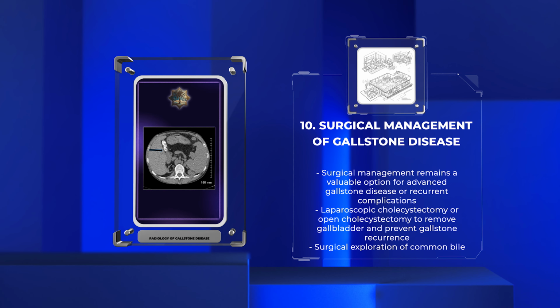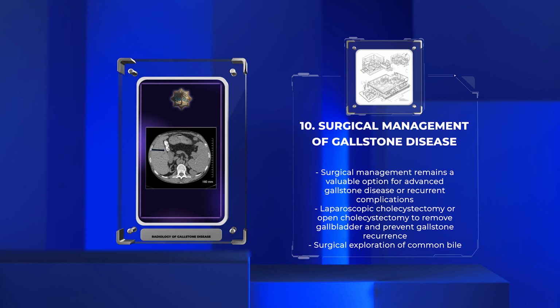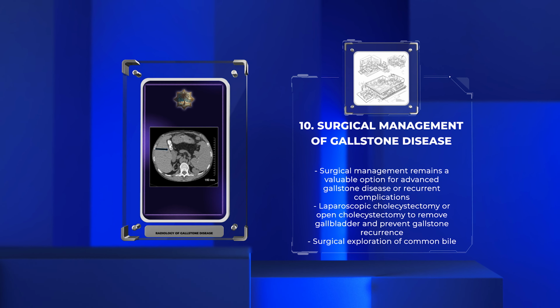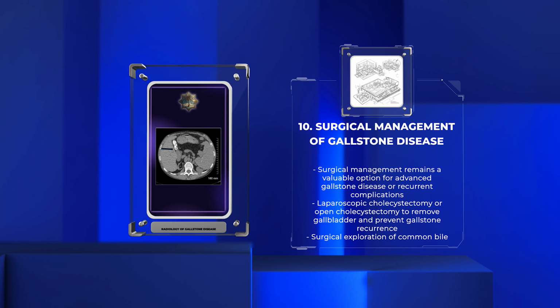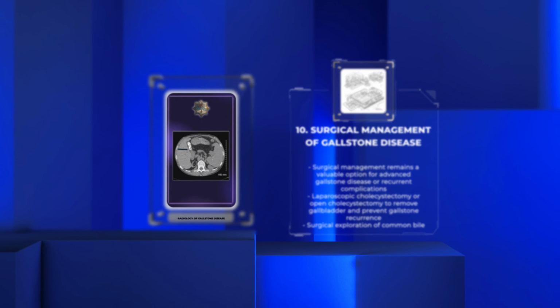recurrence. In certain cases, surgical exploration of the common bile duct may be necessary to alleviate biliary obstruction caused by stones. Radiologists need to work closely with surgeons, ensuring accurate preoperative evaluations and postoperative surveillance to optimize patient outcomes. Scene transitions to the title of the next topic.